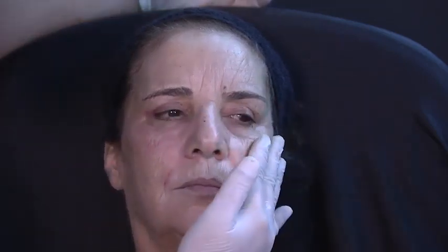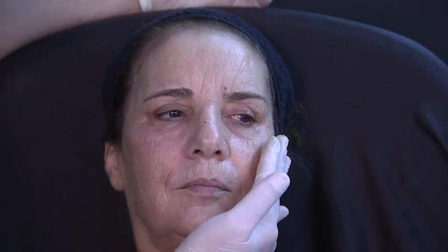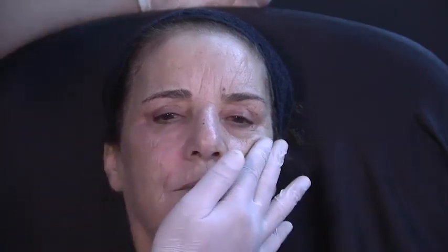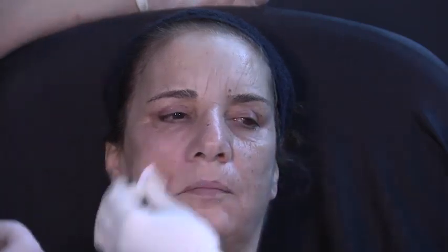And this is just because in our clinics, we cannot afford sometimes to inject with more than 1 ml per side. I will focus on the cheek area, use 1 ml in this area, as we're going to do right now, and then 1 ml in this one. And she comes back in 3 weeks. Then I do a second session with 1 and 1 in the same area, and she will have also a lifting effect.